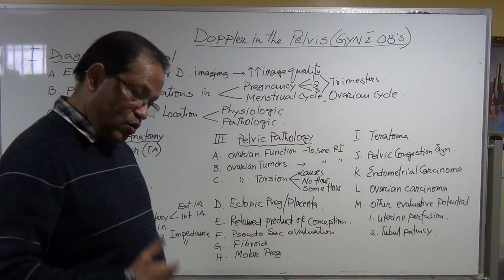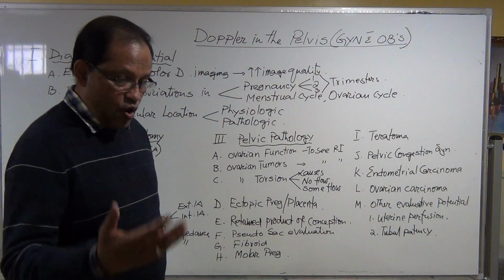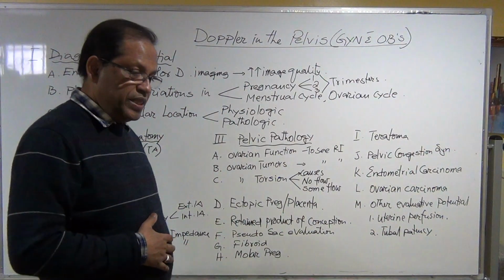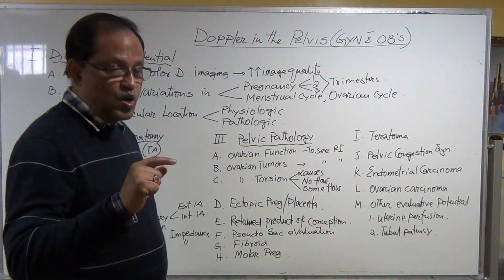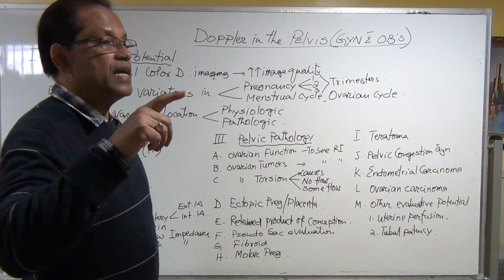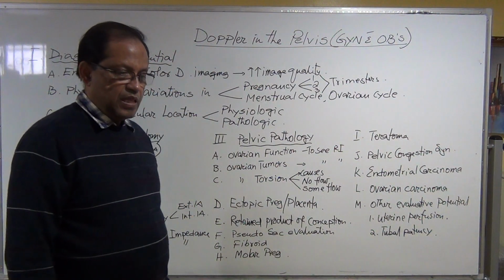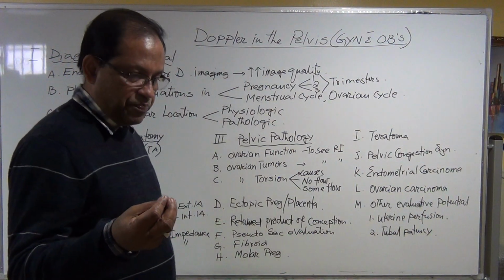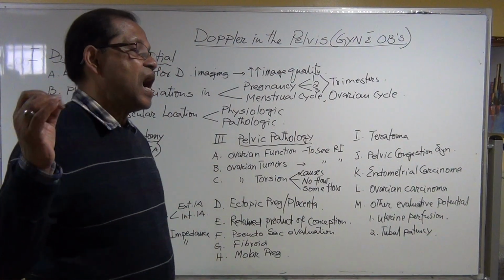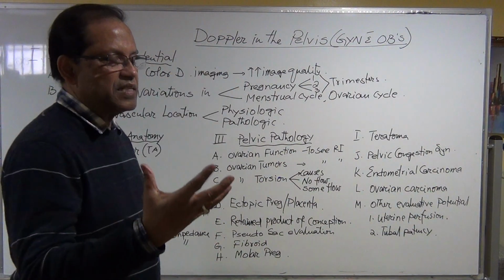Instead of growing the fetal pole, yolk sac, and the normal placenta, the whole gestational sac is filled with the chorionic villi, abnormal shapes or forms of the chorionic villi. Usually it looks like a bunch of grapes. And sonographically, it is anechoic, just like a honeycomb with the echogenic walls. And it is hypervascular. If you click the color, then you will see the whole mass is hypervascular.